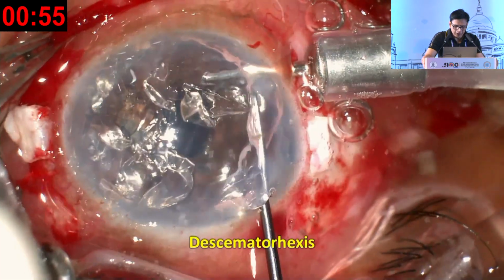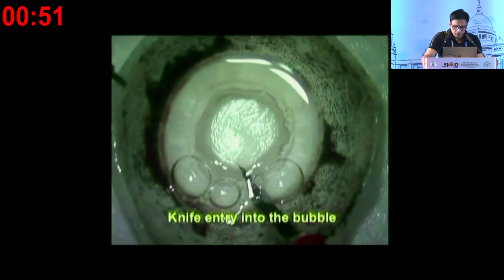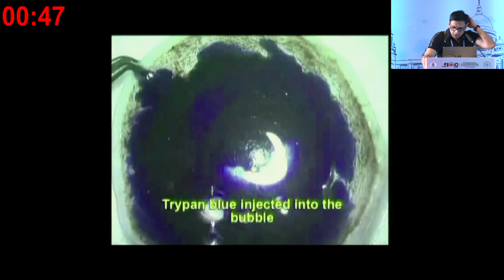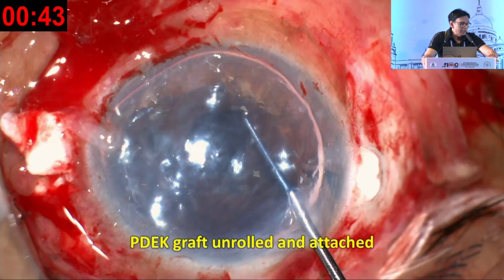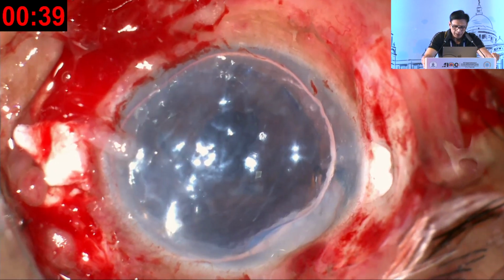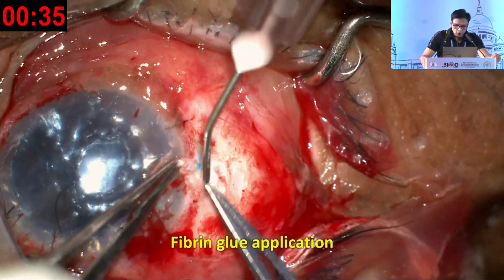I'm going to take off the endothelium Descemet's complex. We always do the PDEC technique, pre-Descemet's endothelial keratoplasty. I'm making my graft ready. Once this has got endothelium, Descemet's and the Duas layer, I will now inject it inside, unroll it and fix it. So end stage, let's see how this patient behaves at the end of the day.